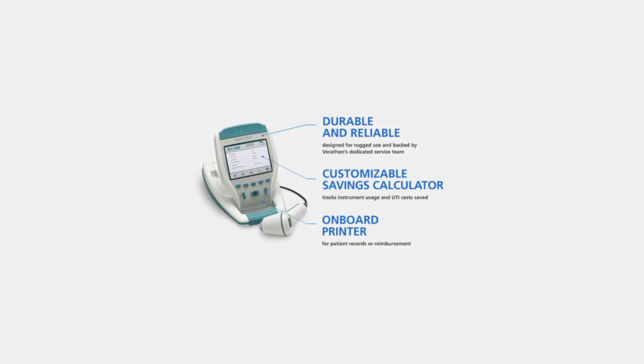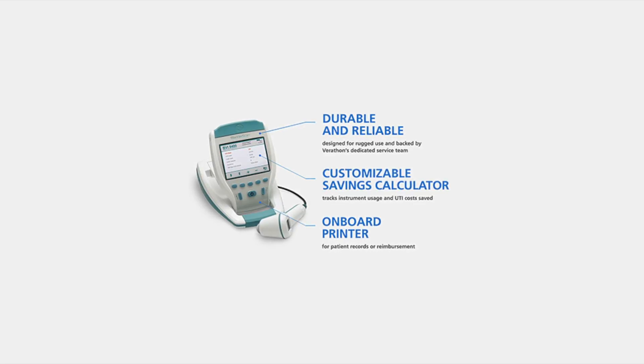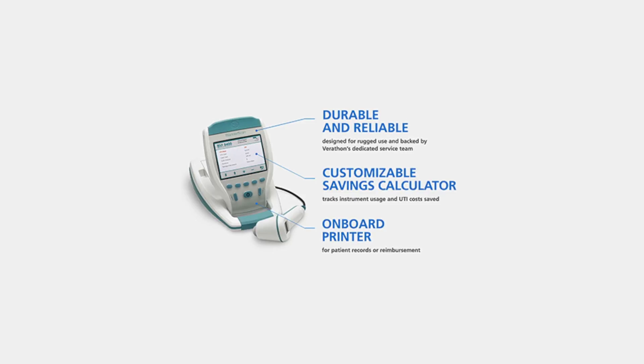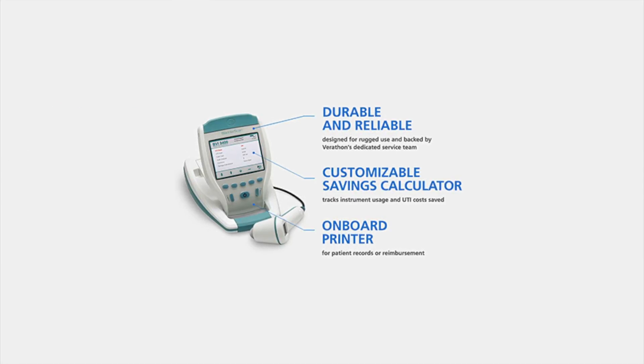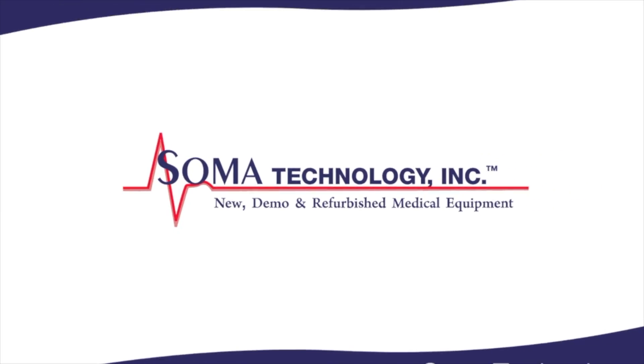The 9400 features an easy to read color display console with brightness control and a handheld probe. To view more information on the Bladder Scan BVI9400 or other products, please visit somatechnology.com.